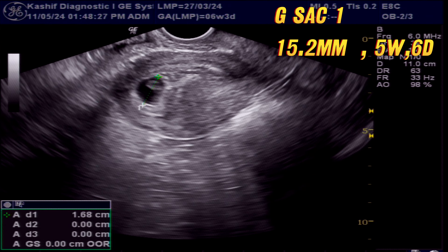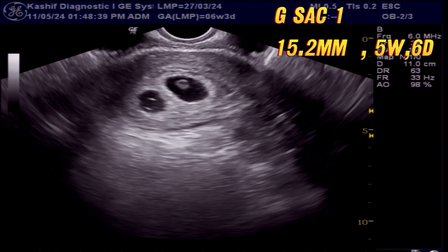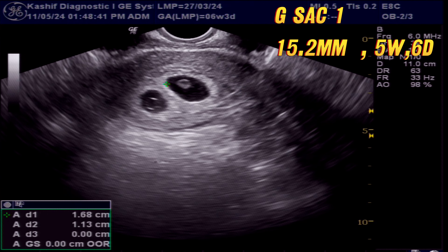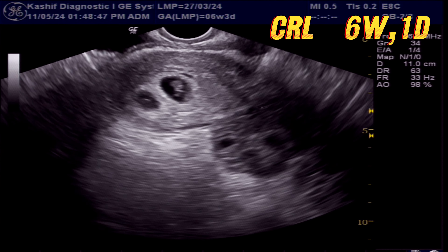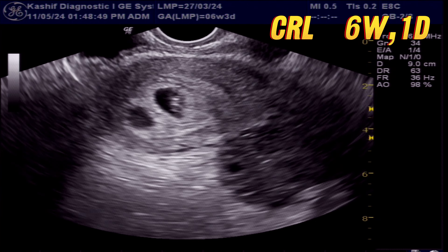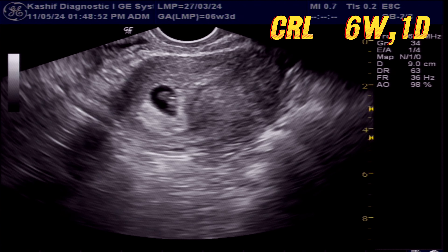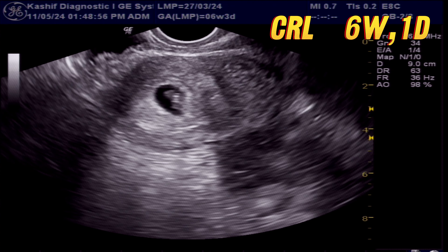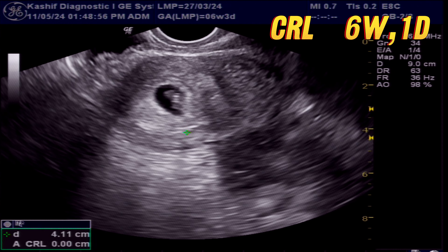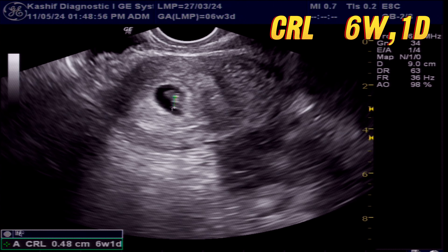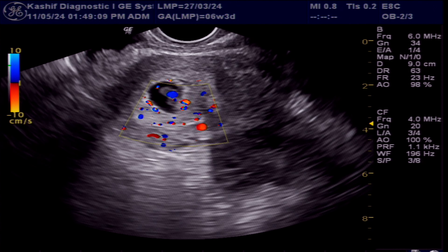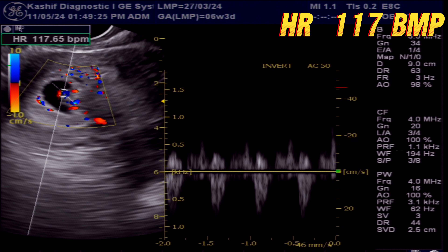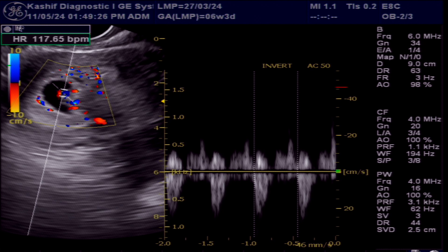Gestation sac 1 has a mean sac diameter of 15.2 mm, corresponding to 5 weeks and 6 days of gestational age. There is a small live fetal pole in this sac. According to CRL, the gestational age is 6 weeks and 1 day. Heart rate is 117 beats per minute.